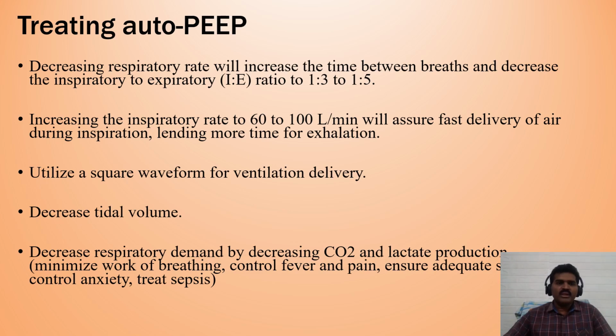Utilize a square waveform for ventilation delivery, which we will know when we talk about the waveforms for mechanical ventilation. Reduce the tidal volume. Use 6 to 8 ml per kg of tidal volume. Decrease the respiratory demand by decreasing CO2 and lactate production. Minimize the work of breathing. Control fever and pain. Ensure adequate sedation. Control anxiety and treat sepsis. These are the modalities you can use for treating auto-PEEP.